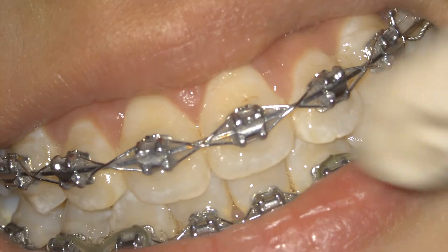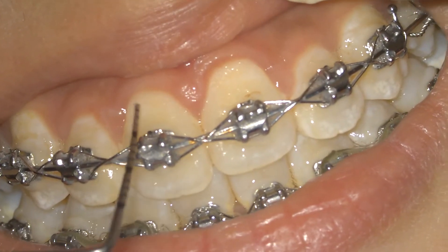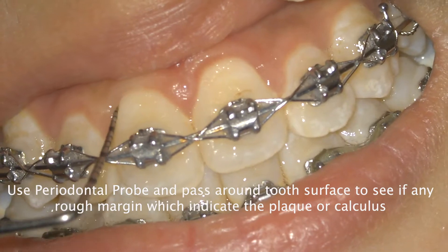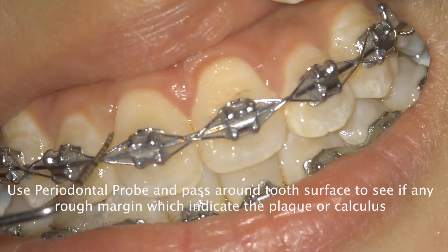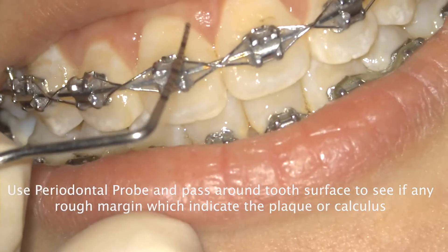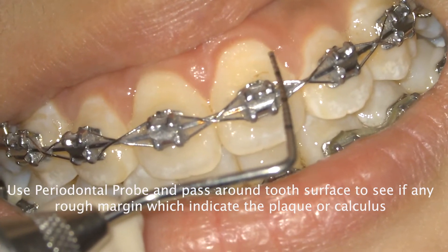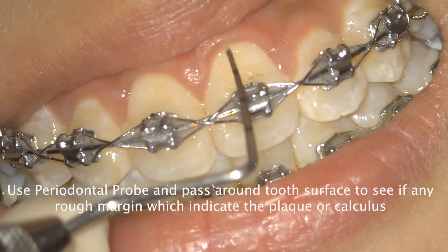Another method is to use a periodontal probe and pass it around the tooth surface or around the gingival margin to visualize and feel if there are any rough margins that indicate the presence of plaque or calculus.